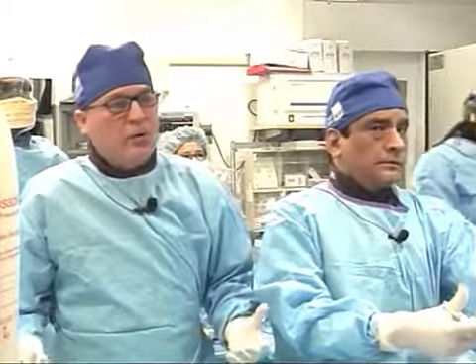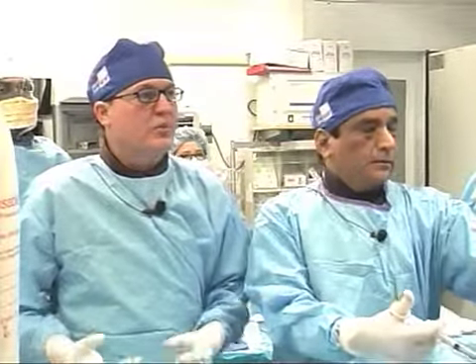Well, we are analyzing the reasons right now. It's tough to say; you can have issues with the connections, you can have issues with the resolution. So occasionally we have these issues, but today in vivo we have less time, so we just move on and I do the rota. Sure, we'll still try to do it in the end.